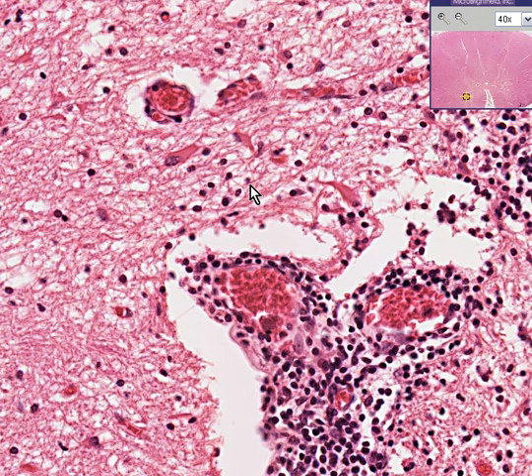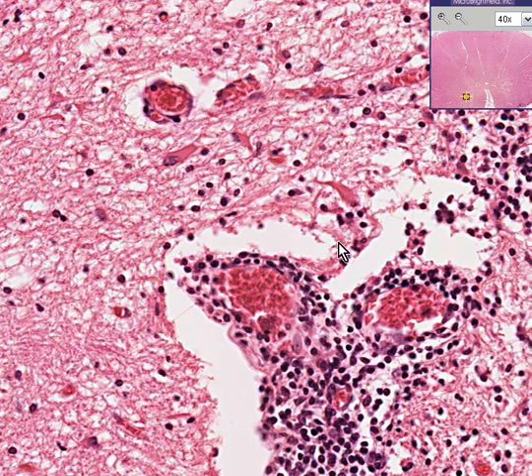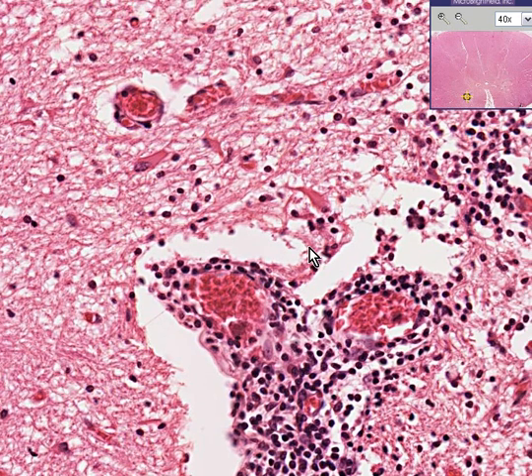These anterior horn cells, the motor neuron cells controlling the muscle we just saw, are being destroyed. They are being destroyed by an inflammatory process. The chief and most common inflammatory process involving motor neurons of the anterior or ventral horns is the poliovirus.